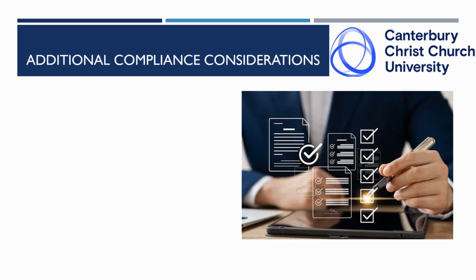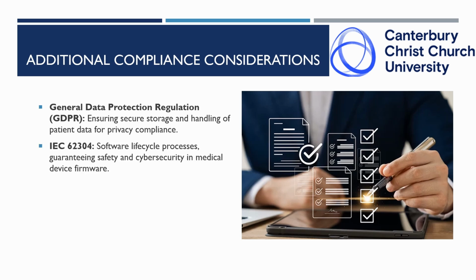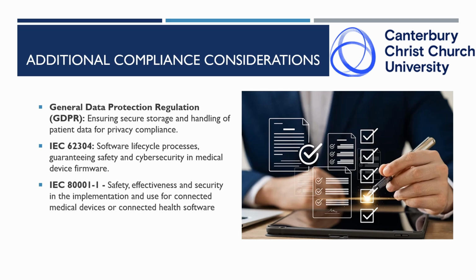Additional compliance considerations. Other things we had to consider while designing this project are things like the General Data Protection Regulation, ensuring secure storage and handling of patient data for privacy compliance. IEC 62304 covers software lifecycle processes, and we'll go into this in more detail later, but this guarantees the safety and cybersecurity in medical device firmware. And IEC 80001-1 covers safety, effectiveness and security in the implementation and use of connected medical devices or connected health software.